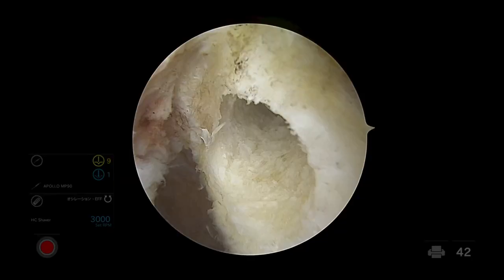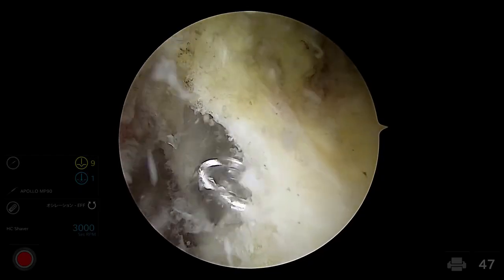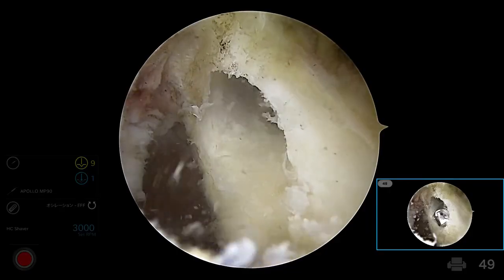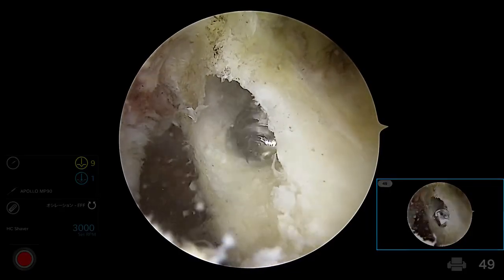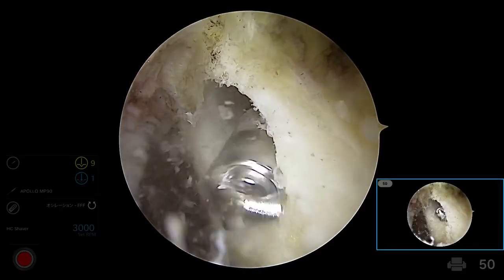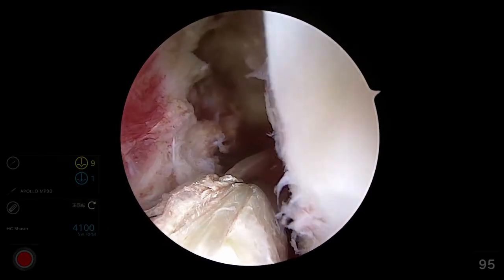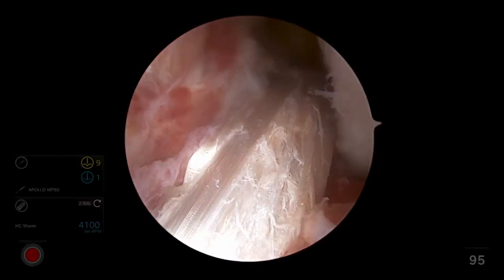After the initial hole is made, the flip cutter is then tilted to make the oval tunnel. This is done by carefully tilting so the step drill sleeve points more inferior and distal. The hole produced with this motion will now become the new oval femoral tunnel. Tibial tunnel is then made accordingly and graft is passed.